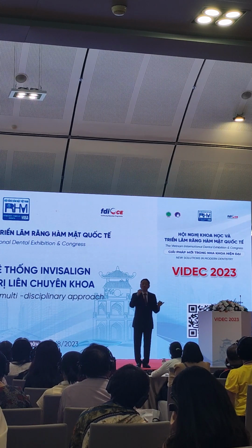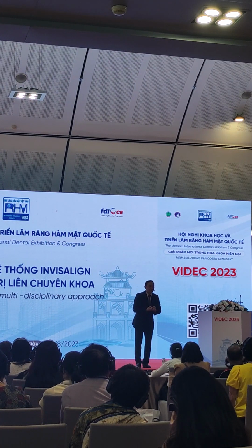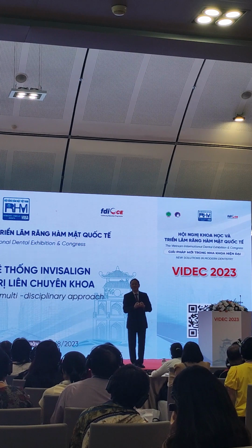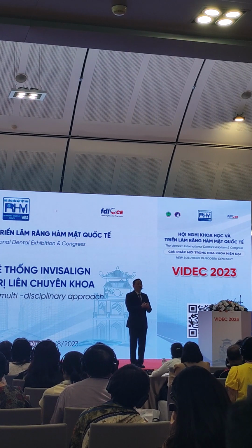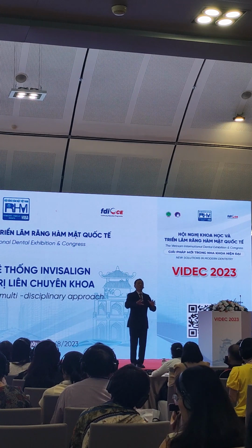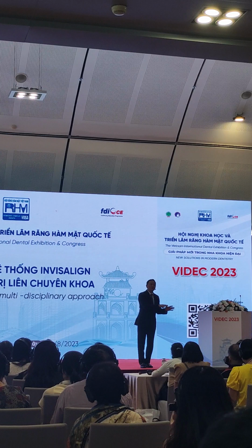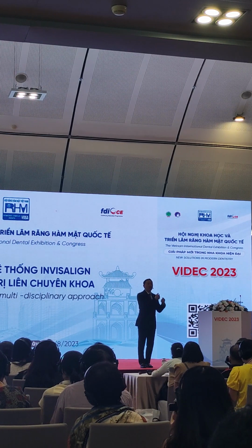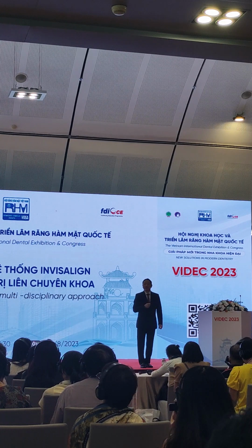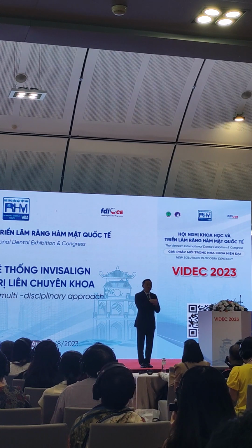And also, I will reduce the wearing time. And then I will get more contact. But more contact doesn't mean it is all good contact. Some are premature contacts. Some may be interference. So, usually, no matter whether during the treatment or closer to the finishing of the treatment, when we get more contact, I will do some minor adjustment. Okay, this is also one of the ways for us to settle occlusion.